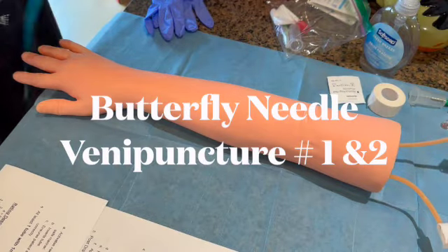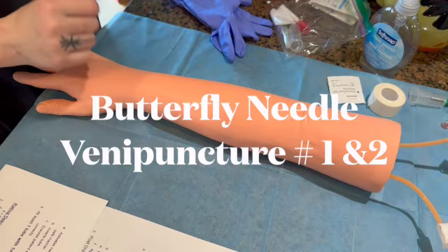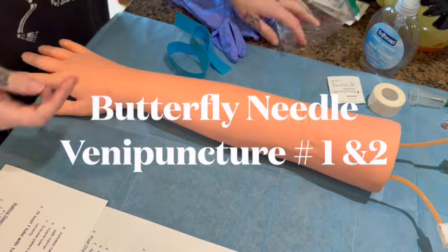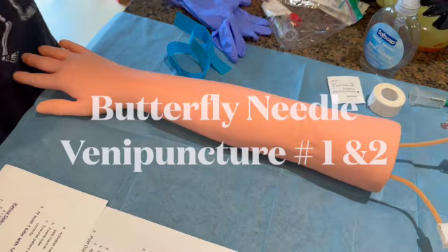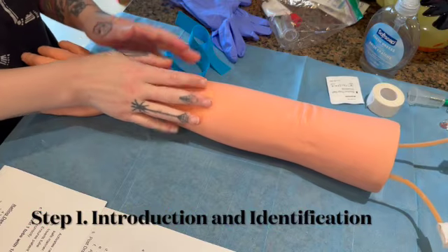And so we're going to do the same thing here for our patient going into the butterfly. We're going to introduce ourselves, do introductions as well, introducing myself and stating my purpose. I'm going to verify the patient name and date of birth.